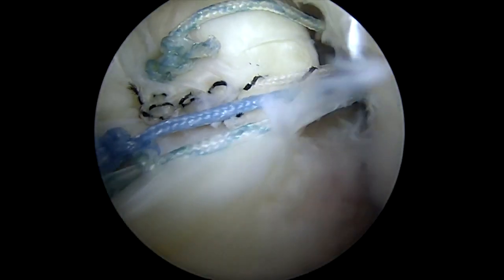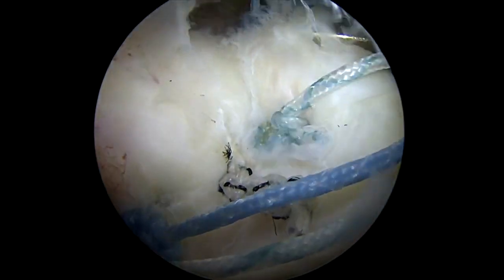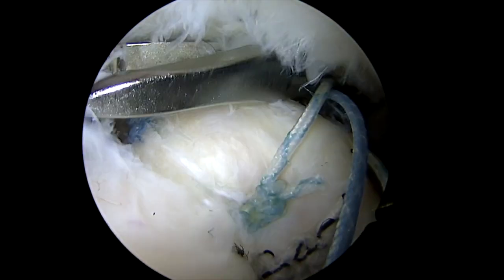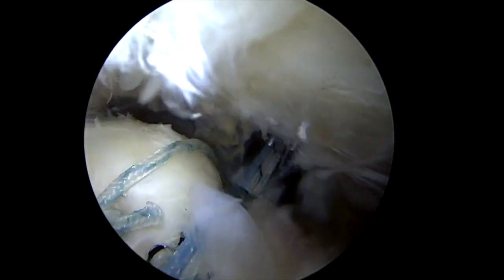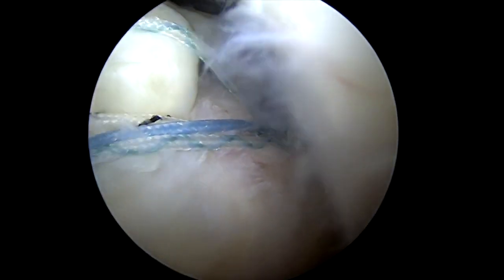Usually we're just going to use one anchor here — occasionally there's enough that we need two, but this tear only requires one. So we'll grab each of those sutures and then we're going to bring them down into a second anchor on the side, and that'll bring that outside edge of the tendon down and compress the tendon against the bone to help make sure that it will heal.